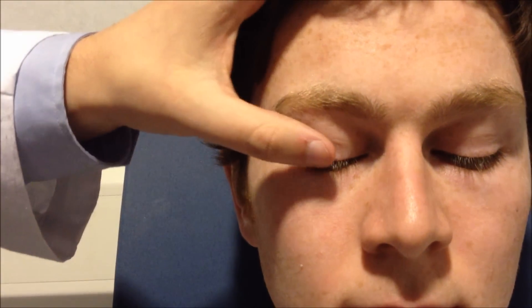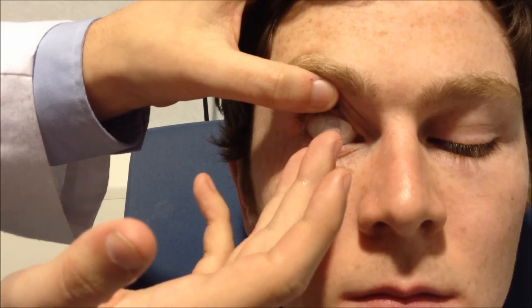What you want to do is just get them to look down — so if you look down for me, Sean. Use your thumb, hold at the base of the lash and bring the lid up, then hold the lower lid down.